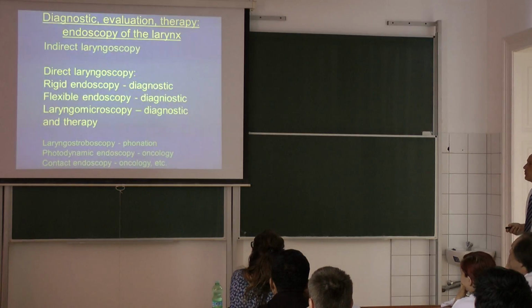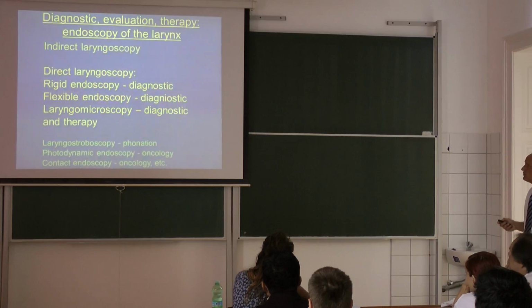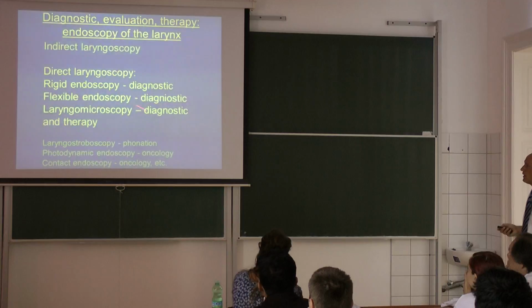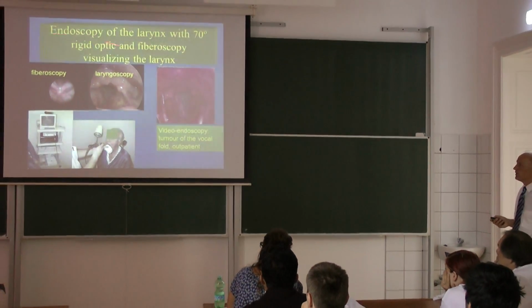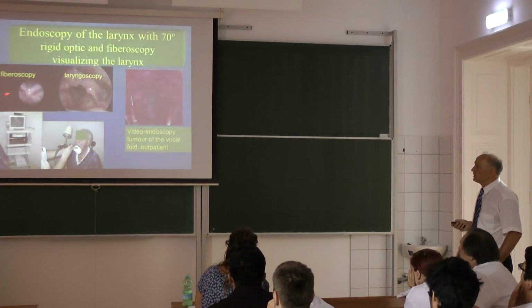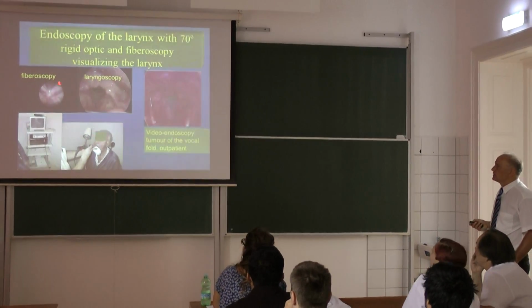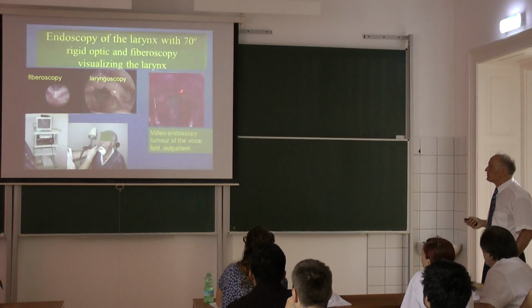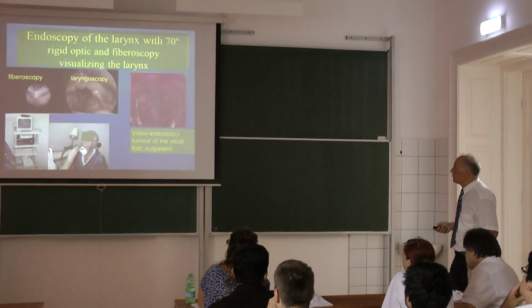We have many diagnostic workups to establish the diagnosis: indirect laryngoscopy and special endoscopies. Here you see on this figure the basic endoscopy, the fiber optic vision of the vocal folds and the larynx. This is the outpatient laryngoscopy, and this is the video endoscopy of a tumor of the vocal fold.